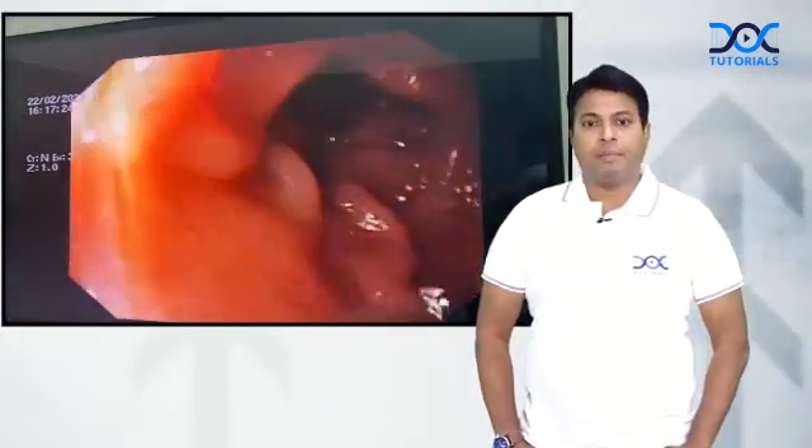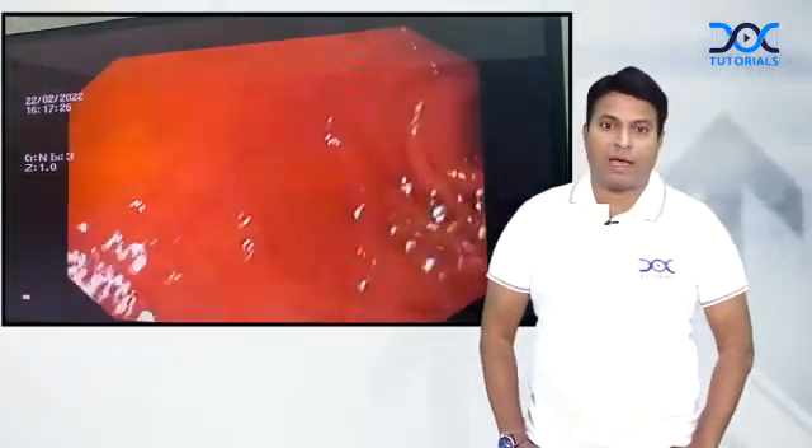Welcome back friends. I am going to show you an endoscopy and what all we do with an endoscopy. You can see I am putting my endoscope inside the patient's stomach — this is the pyloric region.